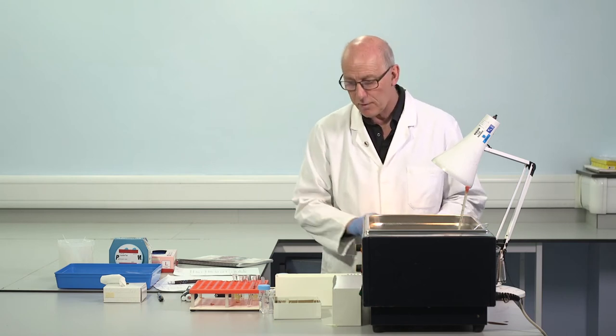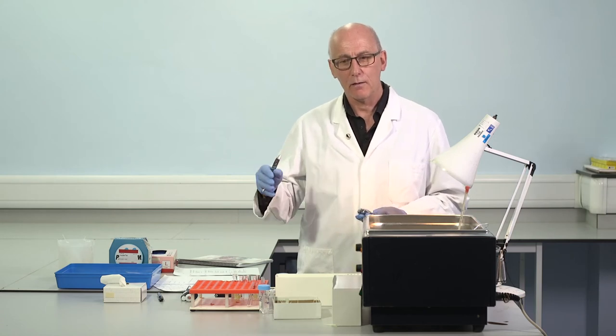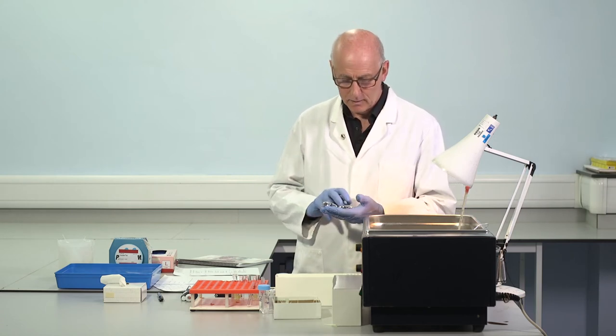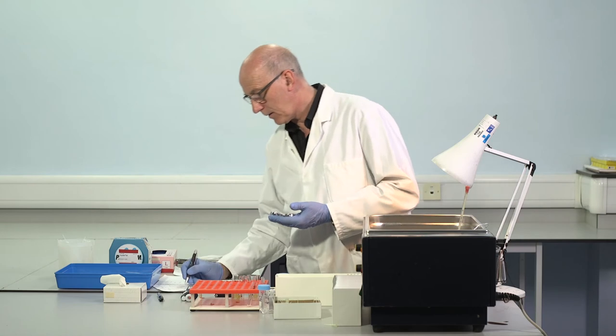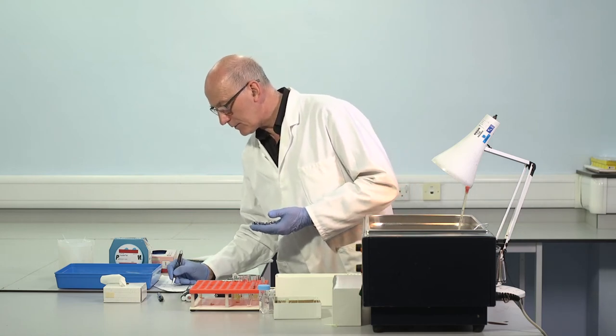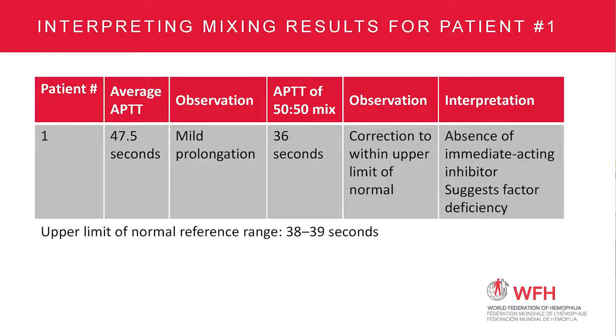Okay, so patient number one, equal volume mixture of pooled normal plasma and patient sample. 35 and a half seconds, 37 seconds. Upper limit of normal, 39. Inside. So the patient alone, 47, 48 seconds. Equal mix with normal plasma. Is it shorter? Yes. Has it corrected back close to or inside the reference range? Yes. In this case, it's just inside the reference range.